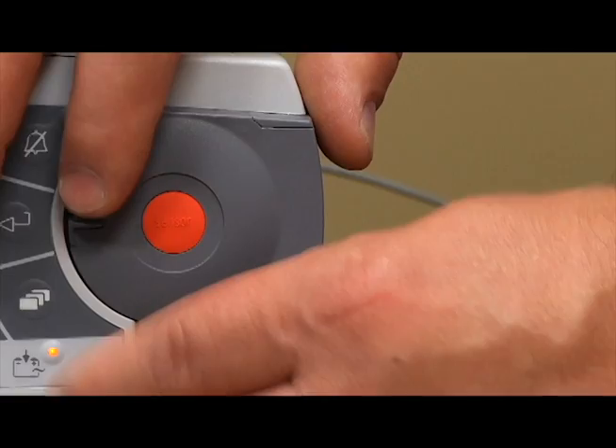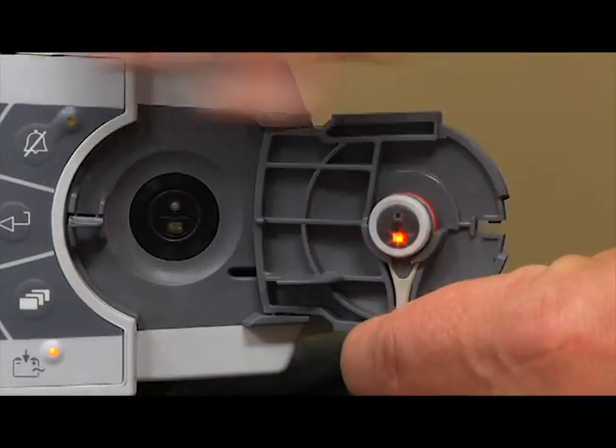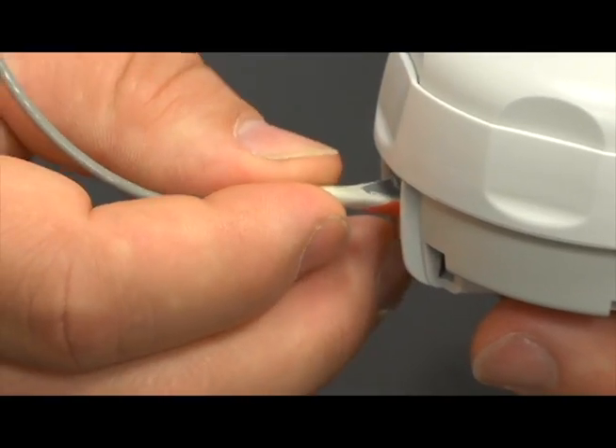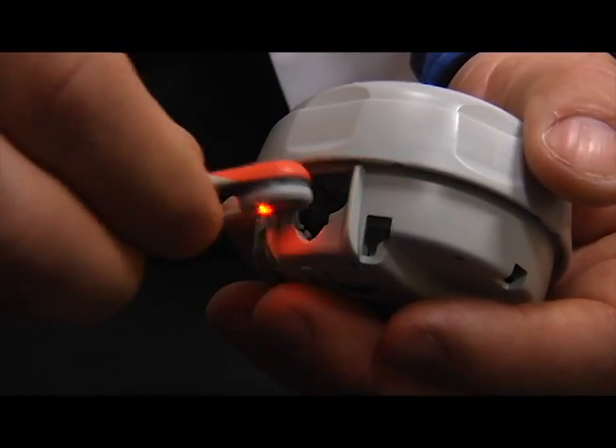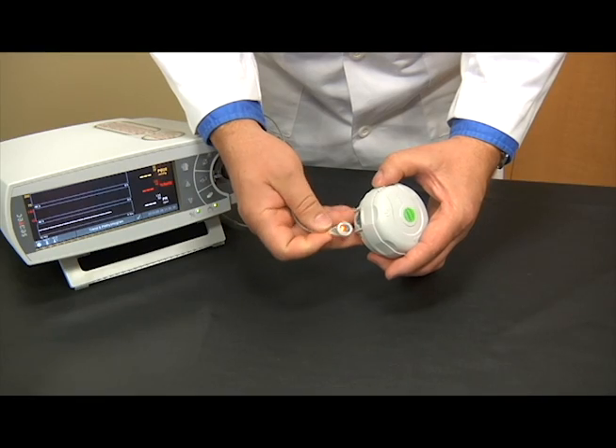Step 2: Insert the V-Sign sensor into the changer with the membrane side facing up. The insert receiver is designed so that improper alignment of the sensor is difficult, if not impossible.